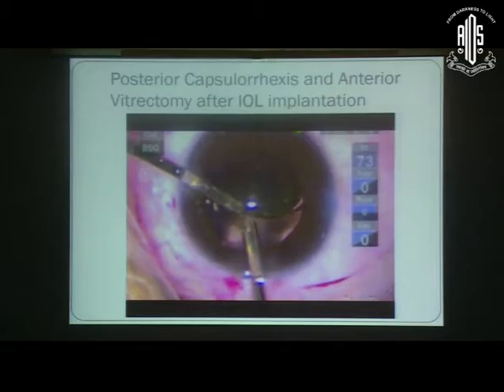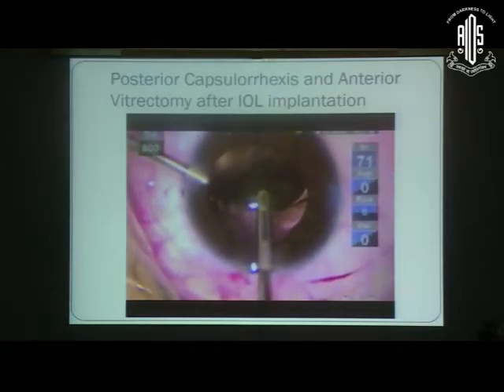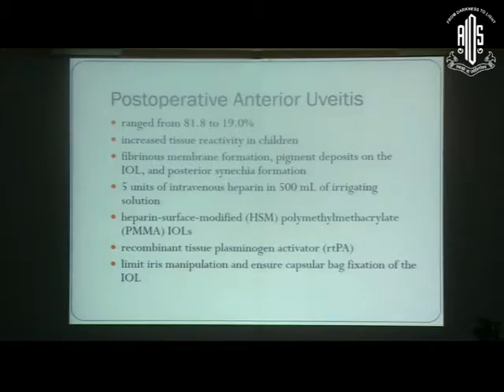So in my hand, this is a much safer technique, and it almost eliminates the risk of losing the IOL through the PC opening. Postoperative anterior uveitis is very common in kids. This is because they have an aggressive healing.